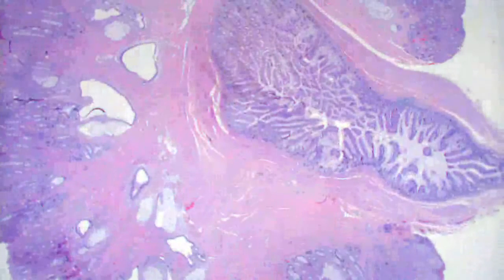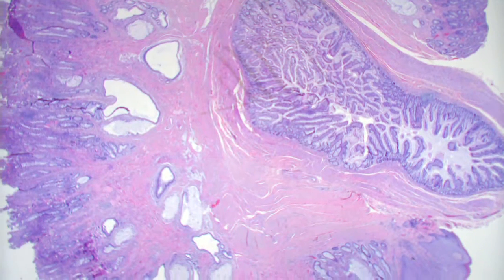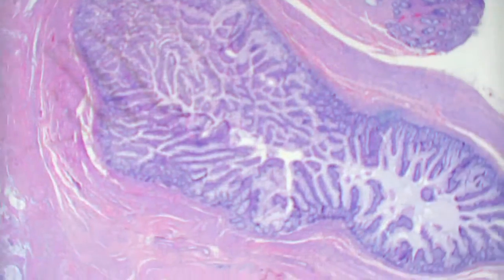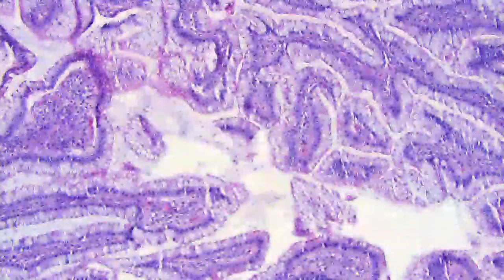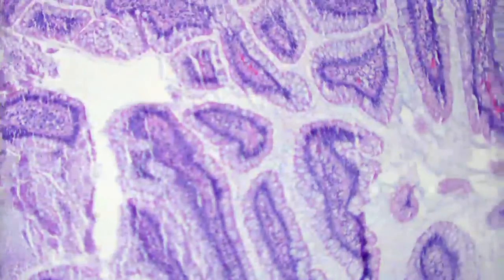Okay, and this looks like a shave biopsy of maybe a pedunculated lesion. Yes. And it has these really interesting structures, and on closer inspection, they look like goblet cells. Yeah, there's a lot of those cells, aren't there? Cells that are producing mucin. There's also neutrophils, blood, eos, lymphs, and so I was thinking some sort of GI type process.